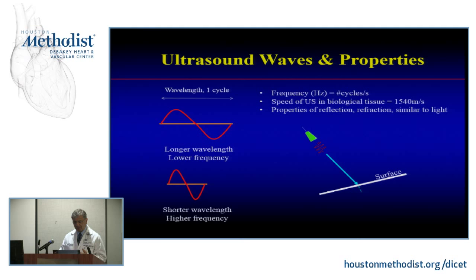Now it reflects and refracts, so if it has enough energy, it's going to go through, and depending on the properties of that surface, it will be refracted and go down further, so it loses some of the energy. Some of it is reflected, so if you're at an angle, if you recall your physics, it will be reflected there, and notice that this line is getting thinner, right?